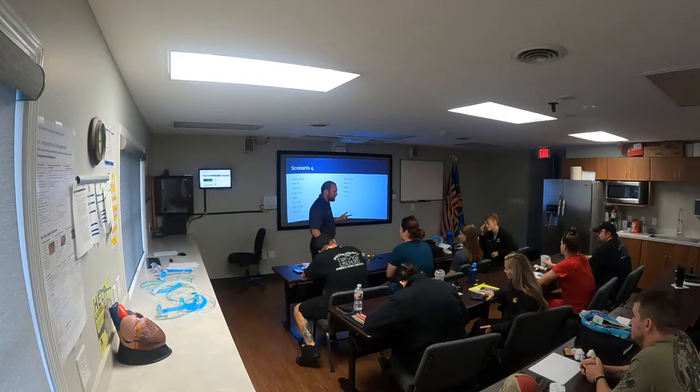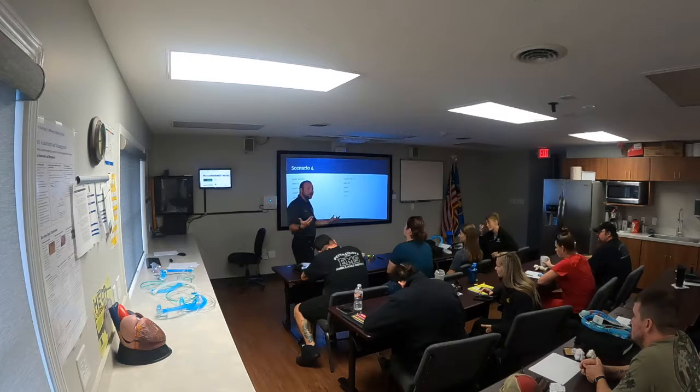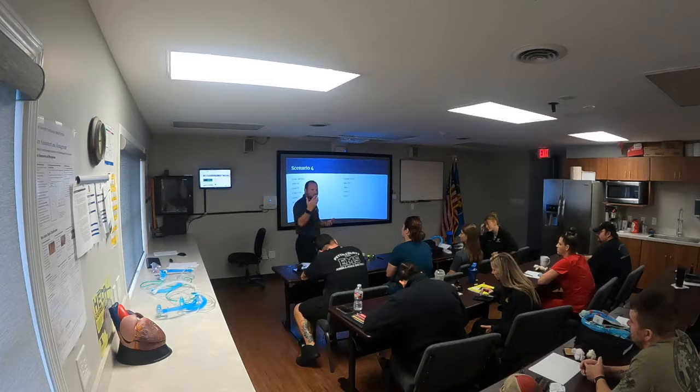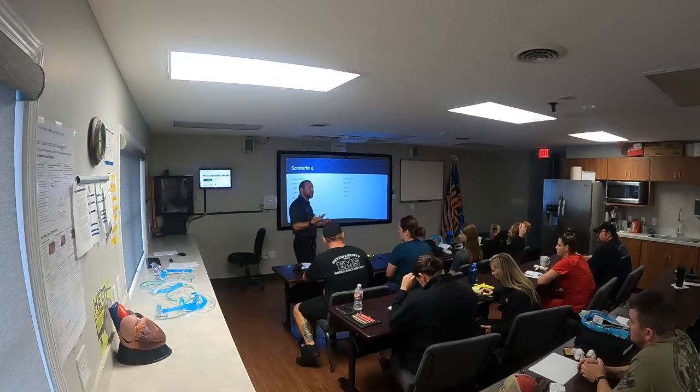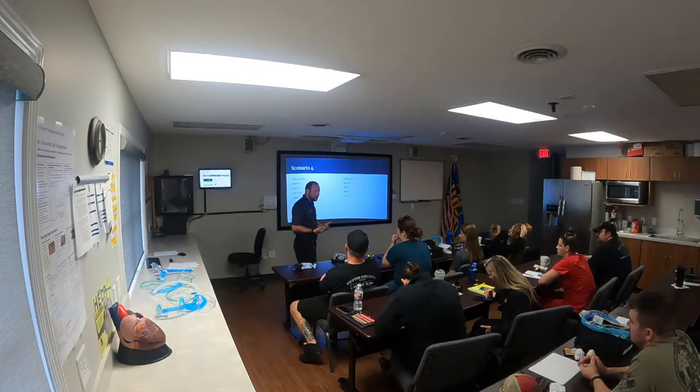For the sake of making sure that we set this up right, I'll have you guys collectively put BiPAP on me. Some things that we are going to go over. I brought the monitor over so we can attach end-tidal so you guys can see that you can monitor that with BiPAP for that patient.